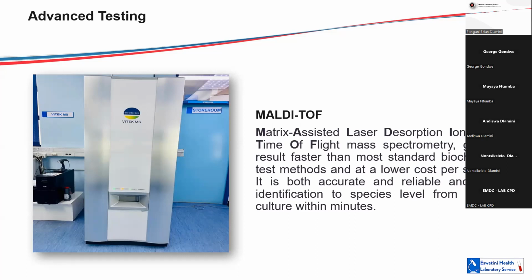The instrument has a database with a lot of microorganisms, so it is able to identify bacteria, yeast, and some mycobacteria, depending on the reagents of the lab. So here in our laboratory, we are able to identify bacteria and yeast. We do not have reagents for the fungi and the mycobacteria, so we do not identify those.